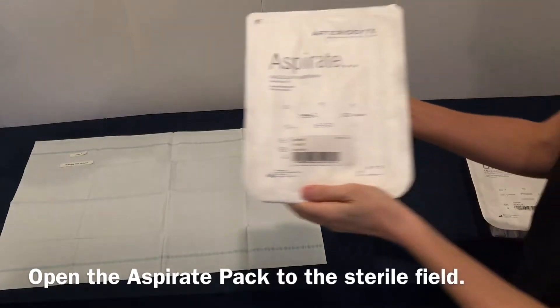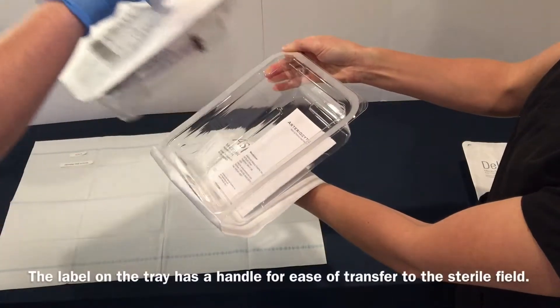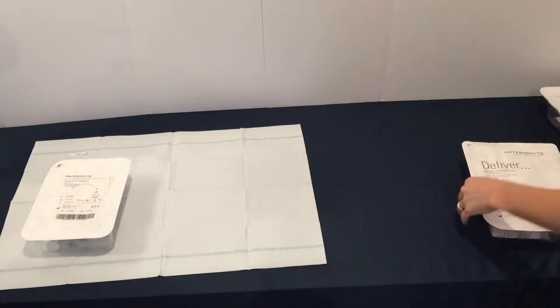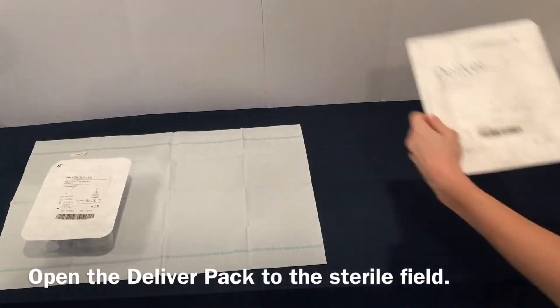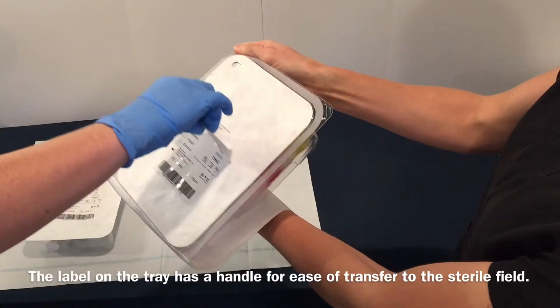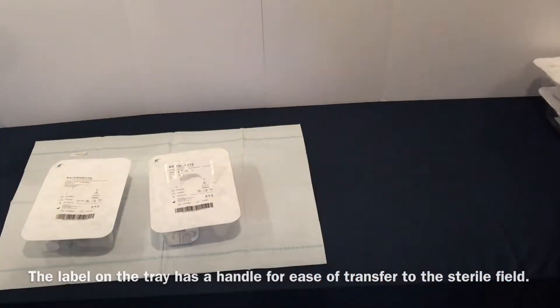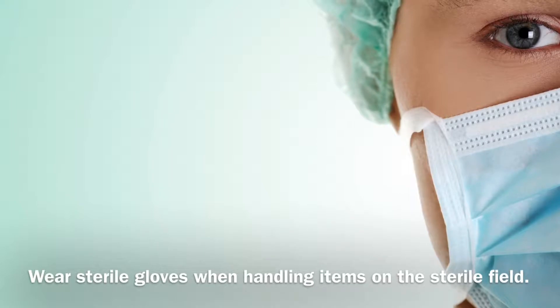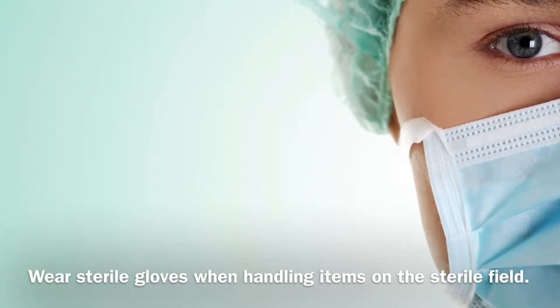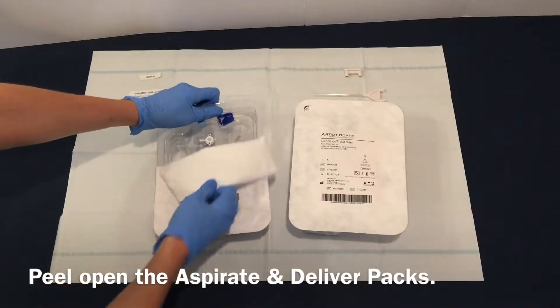Open the Aspirate pack to the sterile field. The label on the tray has a handle for ease of transfer to the sterile field. Open the Deliver pack to the sterile field. The label on the tray has a handle for ease of transfer to the sterile field. Wear sterile gloves when handling items on the sterile field. Peel open the Aspirate and Deliver packs.